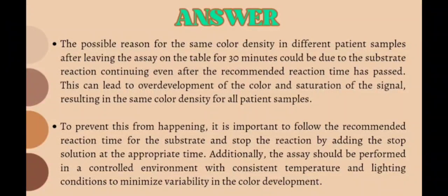So if the substrate reaction continues for an extended period, it may lead to excessive color development across all samples. This can result in the same color density for all the patients, regardless of actual variations in the target analyte concentration. So how can we prevent this from happening? Of course, follow the recommended reaction time.